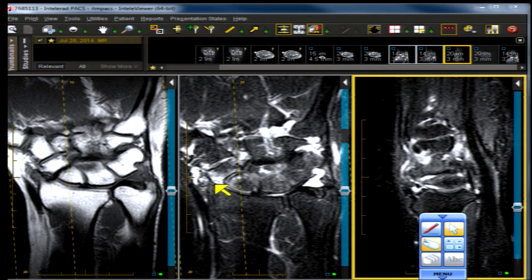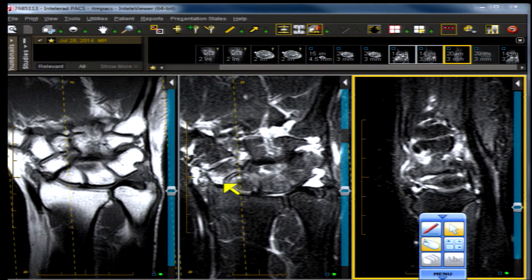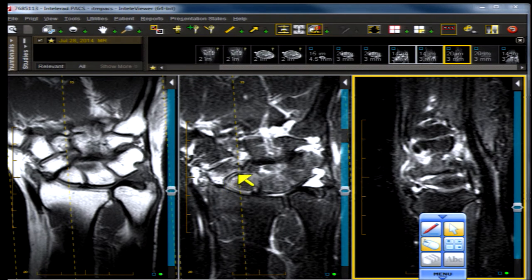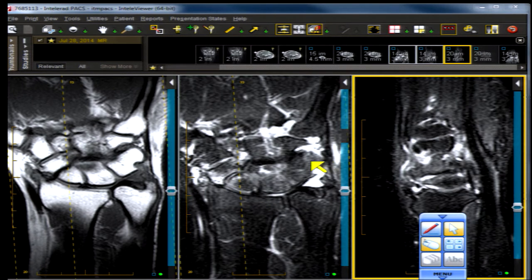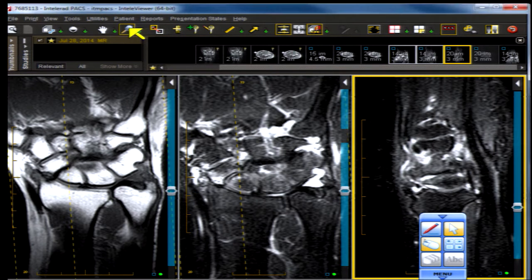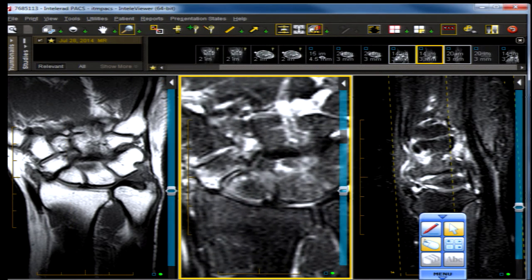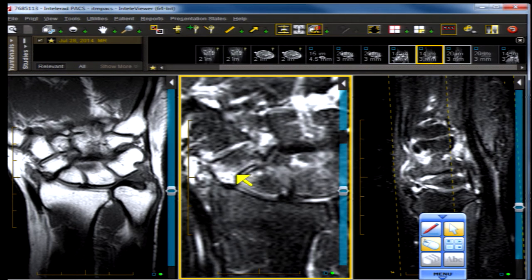We have a fracture through the scaphoid waist — the most common site for fracture — but in the fracture line is an area of high signal intensity that on a T2 fat suppression shows high signal intensity with well-defined cortical margins on either side. That combination — we'll blow it up a little — that combination of high signal intensity with cortication on either side is consistent with a nonunion.